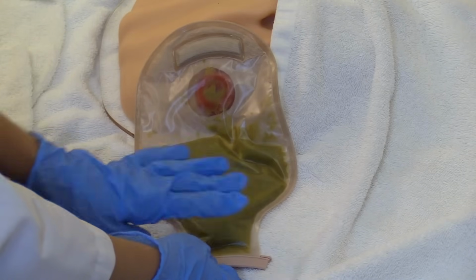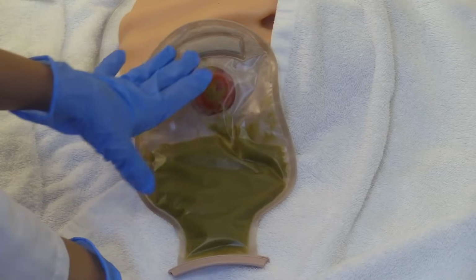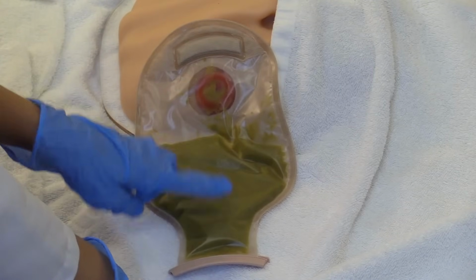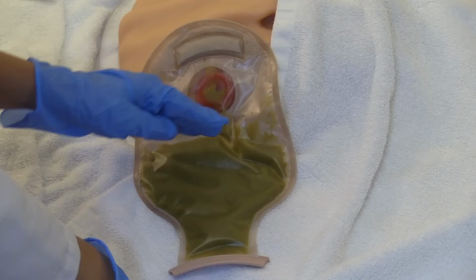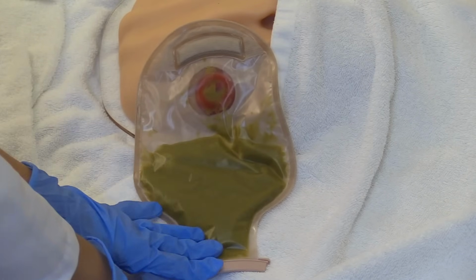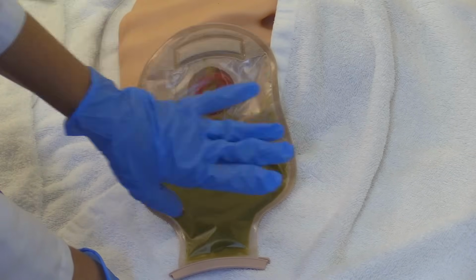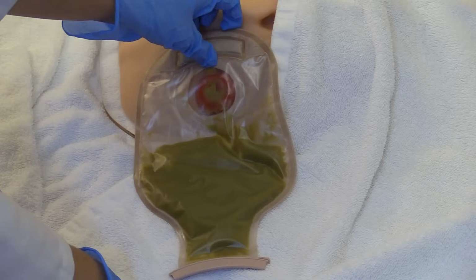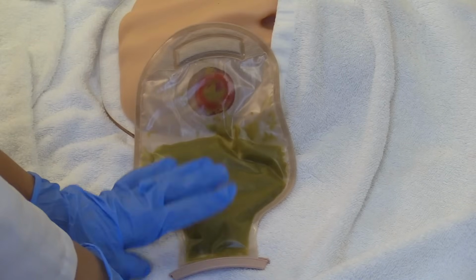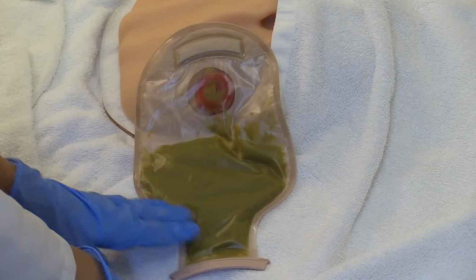Some things you want to keep in mind while doing this: you'll want to change this system about every 3 to 5 days, and you will empty the pouch whenever it becomes 1/3 to halfway full. Here, as you can see, this definitely needs to be emptied, but we're changing the system, so it's good. And while you're doing this, you want to allow the patient to help you as much as possible because they need to become independent in doing this because they'll be doing it whenever they go home.